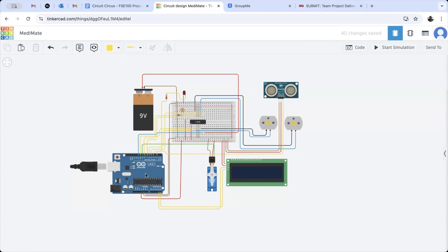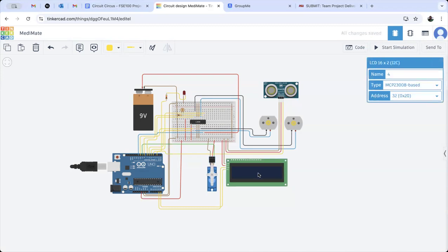First, we have our Arduino board that connects to a breadboard. Along with that, we have a distance sensor and two motors. These two motors will act as pushing or pulling the cart, so in a sense, it has two-wheel drive. Additionally, we have a microservo right here, which will act as the pill dispenser, and we have an LCD display right here. Also, we do have an LED, which we'll show an example of in just a minute.